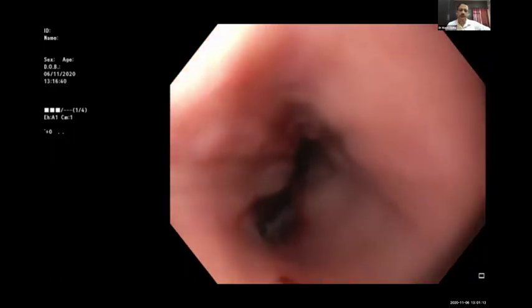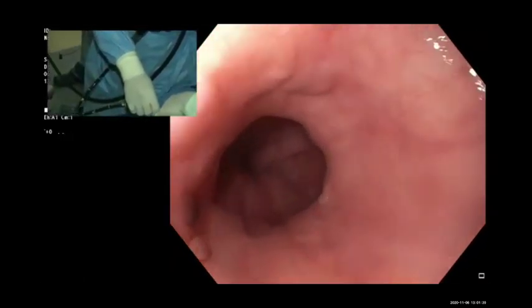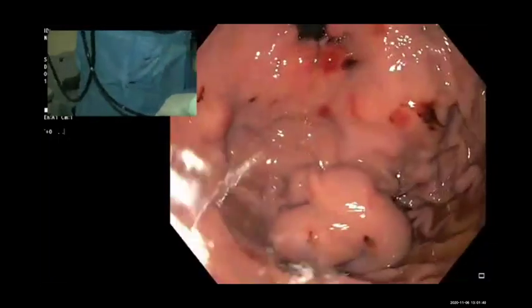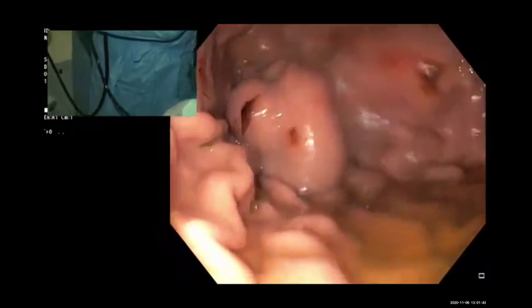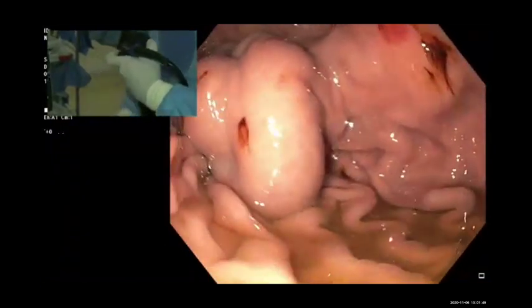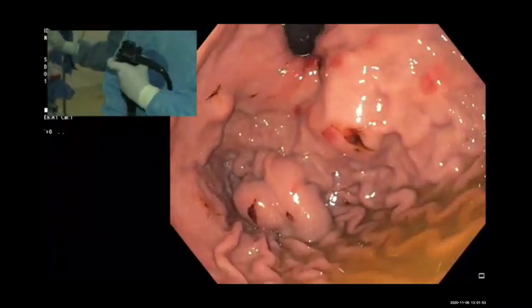So this is the upper GI scope. Are the images visible there? Yes, sir. Okay. You see the esophagus does not have much of big varices, in fact grade 1. Buscopan we can give. I will suck all the material. I will go to the fundus and you see the large GOV1, okay? I think that is very clear: GOV1, GOV2, IGV1 and IGV2. So this is the GOV2, okay?